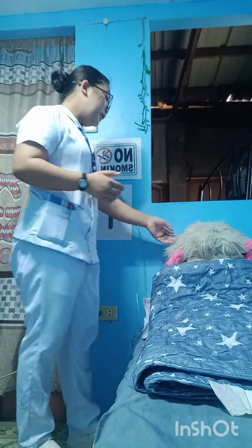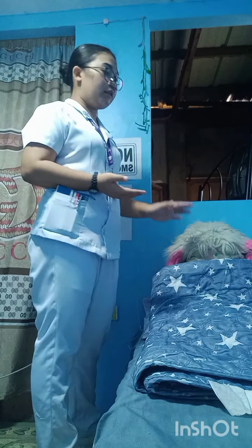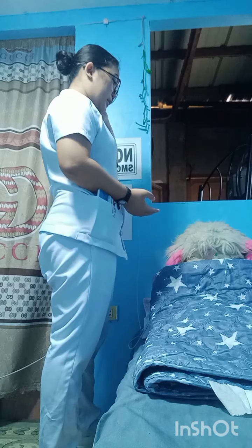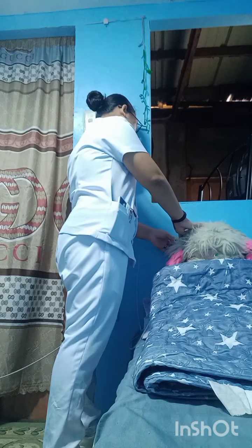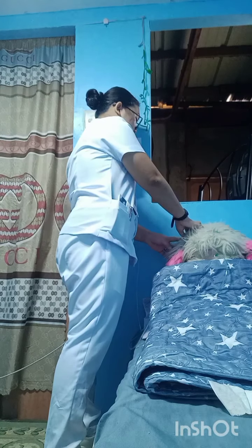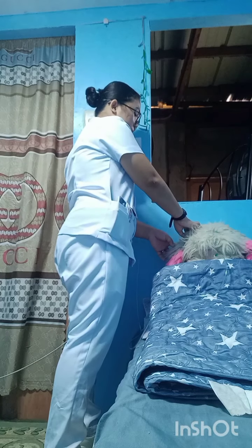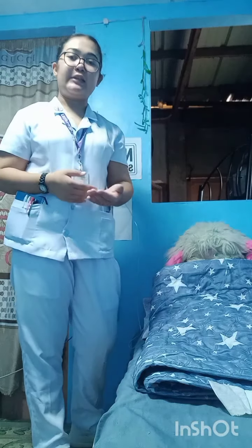Gaya nito, titignan natin, ask tayo ng question sa ating patient na, ma'am, may masakit ba dito or may makati ba? Pwede ko bang tignan? Kung may mga pula-pula ba? Ma'am, kung may pula-pula, pwede nating lagyan ng gauze pad para mawala yung sakit o yung kati. Kagaya ng patient ko, wala naman siyang mga irritation, signs of irritations na aking nakikita. So, there's no need to put a gauze pad over the top of the ears of our patient.